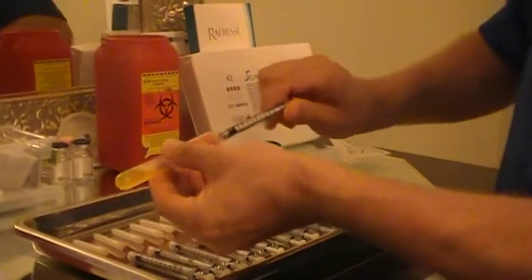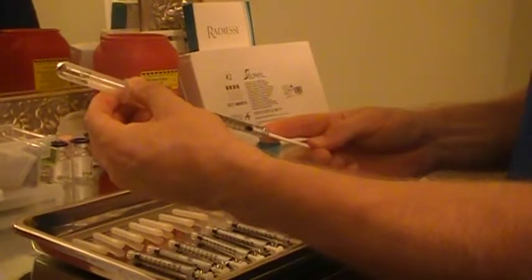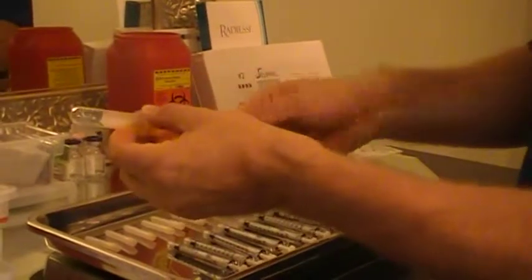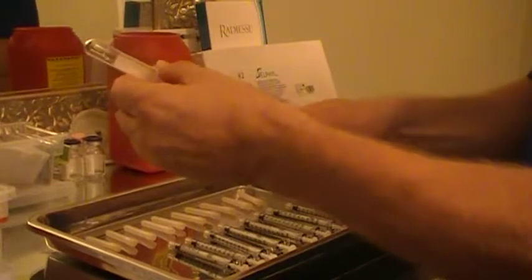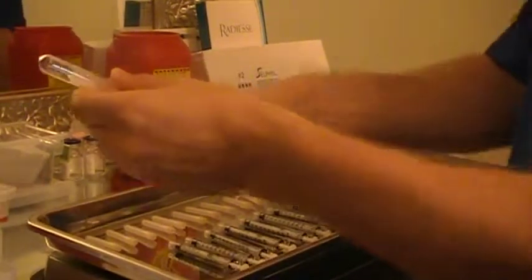attach it to our liquid gold and we're just going to draw up 1 cc. Usually we should obtain about 4 cc of cell fill from this one tube. That's two, and we'll just keep on going.